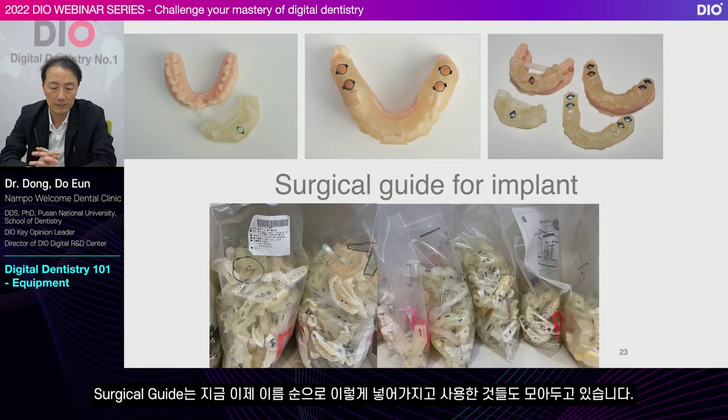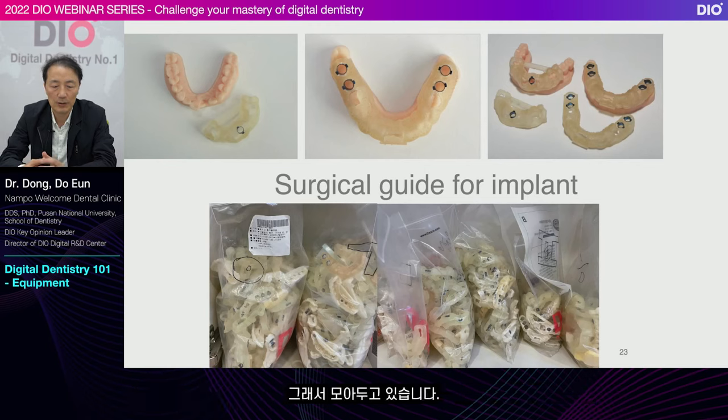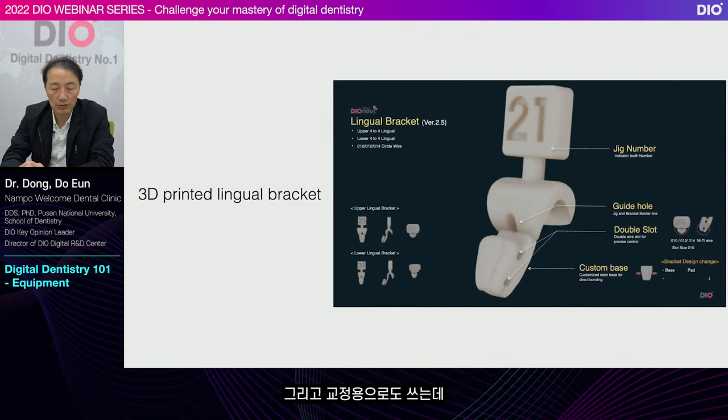For surgical guides, I store them together and arrange them by name like this. There were times it was useful later on for re-implantation or prosthetics, so I saved them. I use the 3D printer to make surgical guides. I also use it for orthodontics.